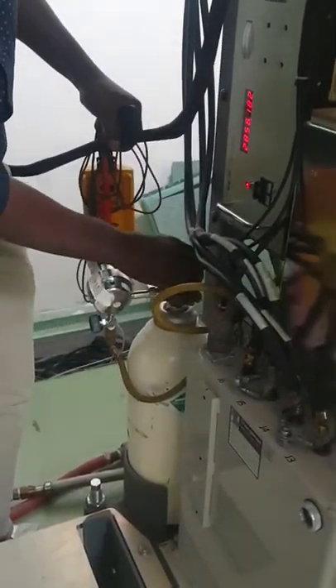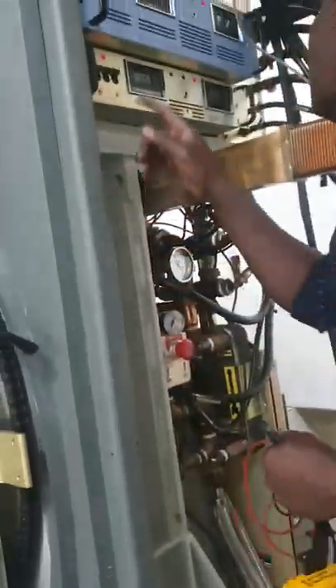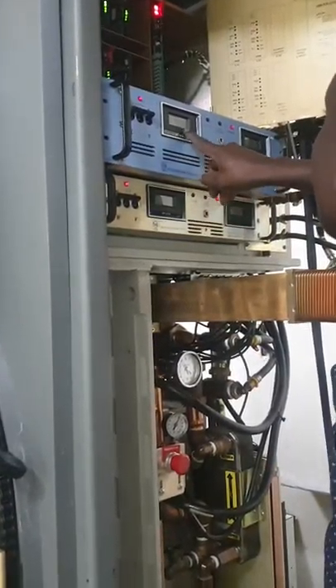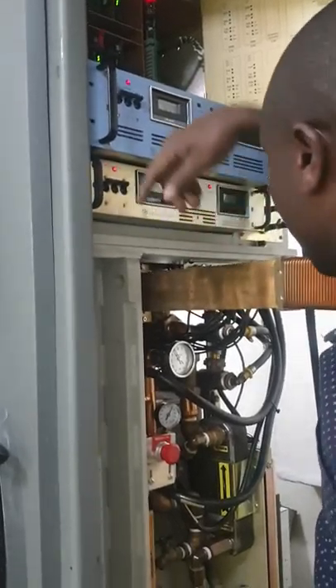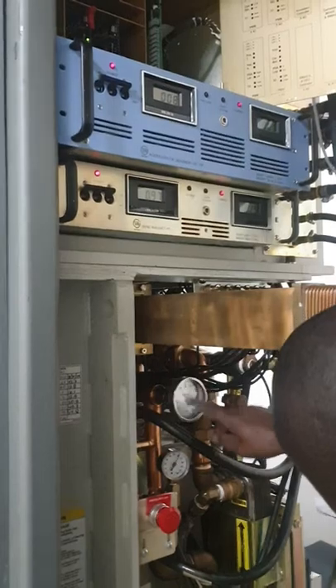That is the cylinder for the gas. After that, he is checking on the bending magnet circuit section, and also the PWM — the klystron filament and bending magnet filament voltages. They are also okay.